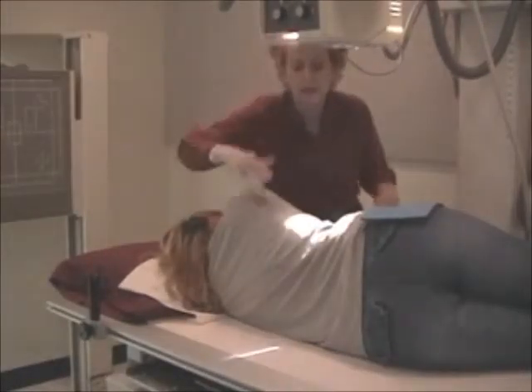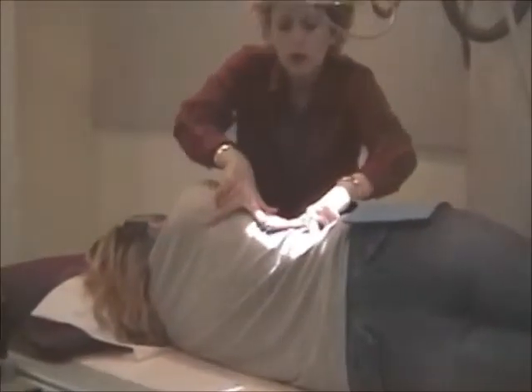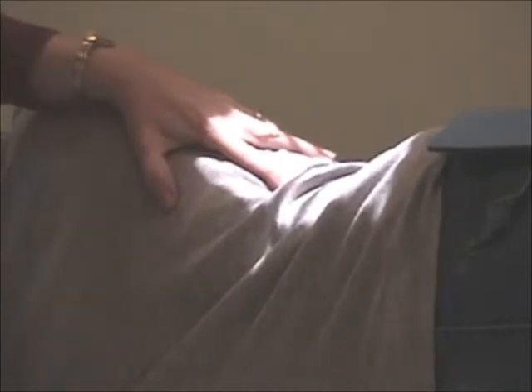I think we can see here. I'm going to use the tip of the scapula, iliac crest. We'd go halfway and then down 1 inch. This would be for sthenic. And then mid-coronal plane. I want to be a little anterior to it, but from my view now, I'm actually x-raying tabletop, so I'm not going to move her forward to truly set the 1.5 inches anterior to the mid-coronal plane to the center of the film.